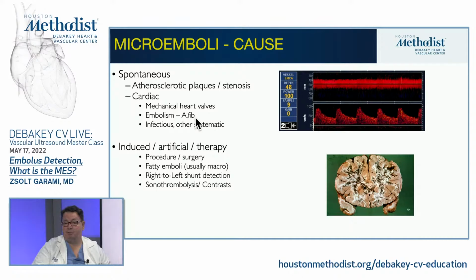The LVAD procedures we also monitor. Very important: in the LVAD, you cannot see inside because it's covered with metal. So when you cannot see inside the metal, you indirectly say that there's an embolus coming out from the LVAD, from the metal, that has to be inside. With a little bit of TPA, you can resolve it. And in a follow-up the next day, there's no emboli. So that's when you see the treatment and you can confirm it.